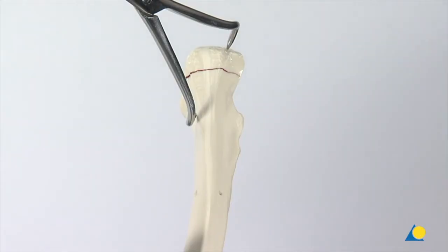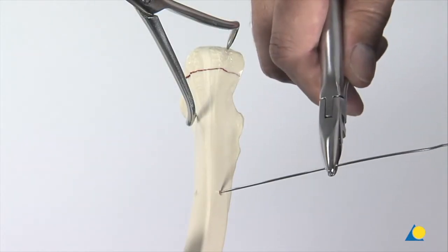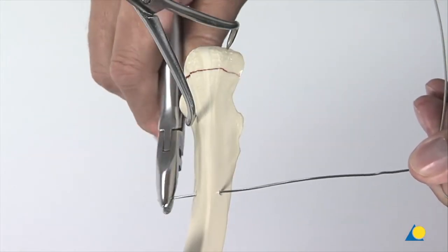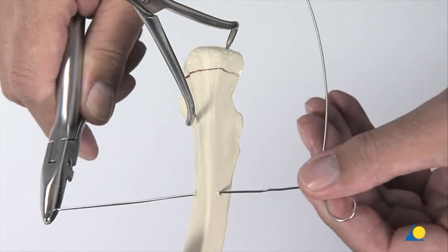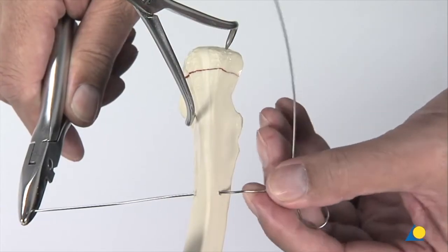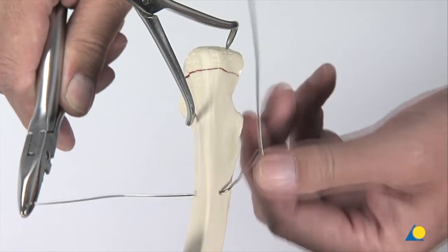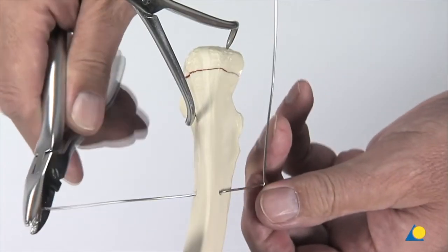The shorter end of the circlage wire is introduced from medial to lateral through the hole using the wire bending pliers. On the ulnar side, the wire is bent near the hole so that the prepared loop lies approximately 2cm proximal to the hole.